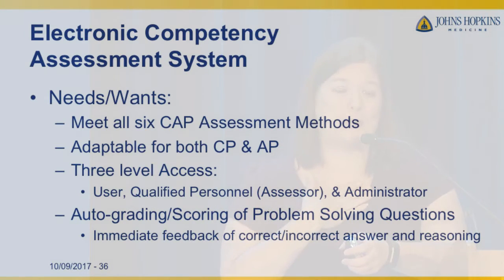So what I want, when we're designing our assessments, because that's another thing we got cited on, once again, not in our laboratory, was that not all 6 assessment methods were assessed, meaning it literally was just not on the thing. So whoever designed the competency assessment didn't include it. So who's going to check that? If you have a system that's going to flag you, says, hey, you don't have number 4, your direct observations of instrument and equipment maintenance and function checks, it's going to flag you for that. Therefore, you wouldn't be missing those things in the future, especially if someone is new to creating competency assessments or the whole department has not done this before. And you can make sure that they're all there.